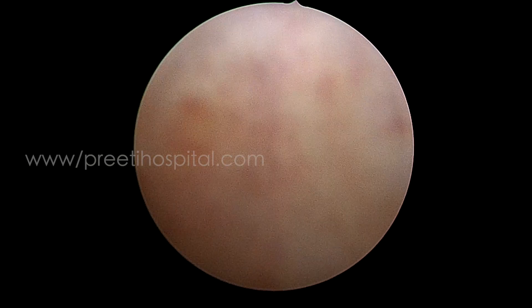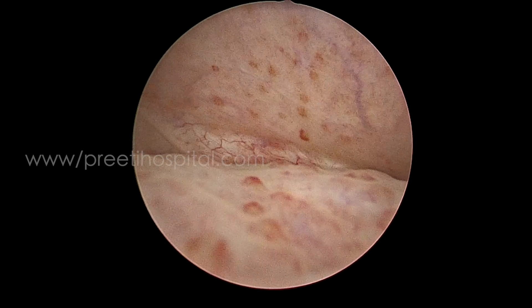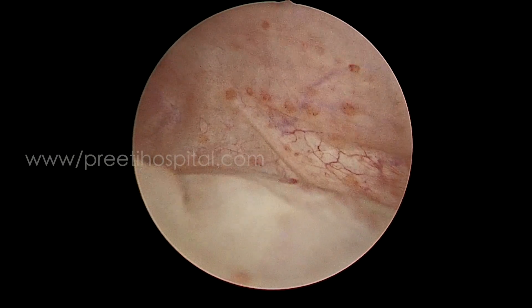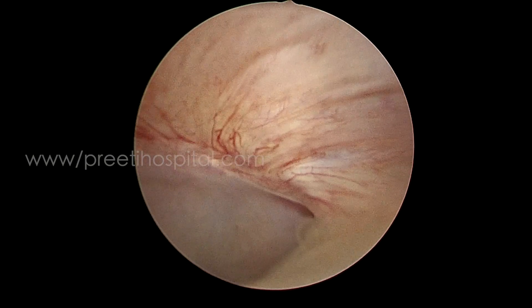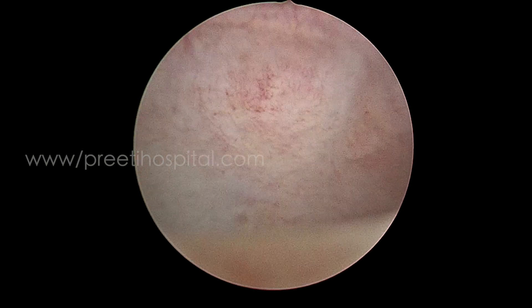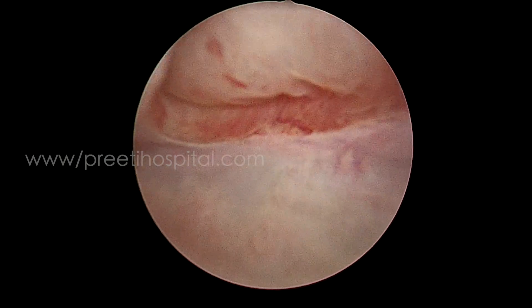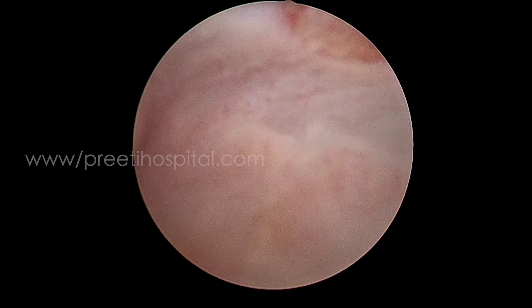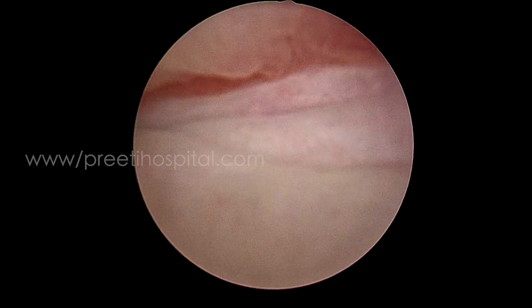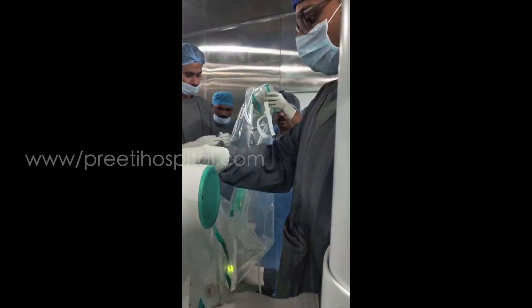In the cystoscopy we identified the fistula, and bilateral ureteric catheters were inserted. One different-colored ureteric catheter was inserted into the fistula. This is done in all cases whether it is laparoscopy or robotic. Being my first case with SSI Mantra reconstructive surgery, I was a little doubtful about suturing, but because of my 15 years of experience in laparoscopy it did not present any problem. After the ureteric catheterization we proceeded with docking of the robot.